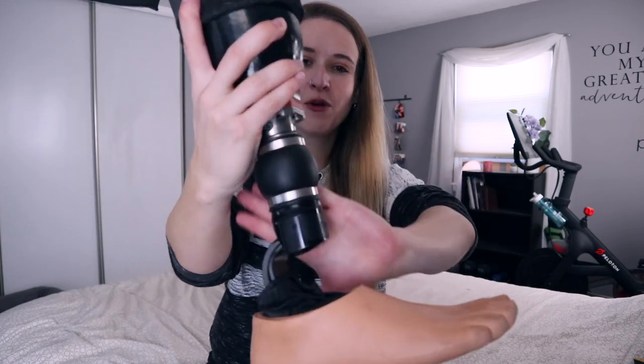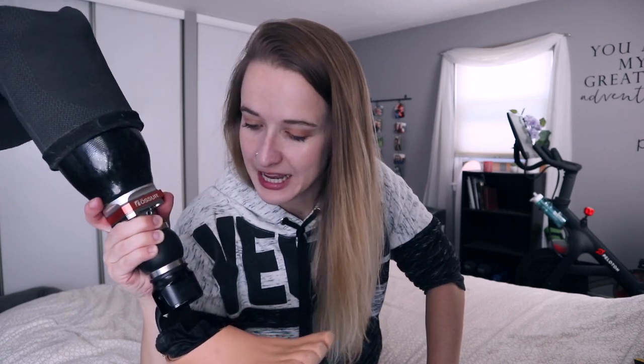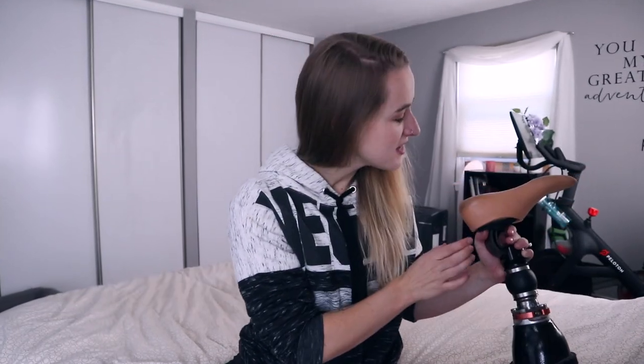This is the Ossur ProFlex XC Torsion. It's got this little torsion ball here, which actually comes in very handy for hiking — that puppy actually does allow for a little bit more movement, which is fantastic. My foot has a hole — oh my gosh, do you see that? It has a hole in it. I legitimately did not see it, and it's got a crack in the bottom. What the heck? Sad.